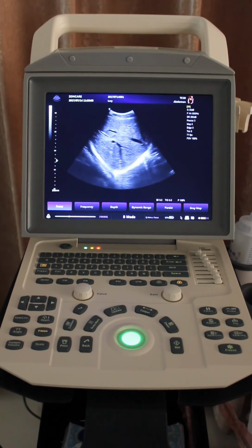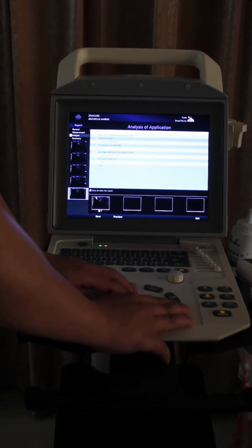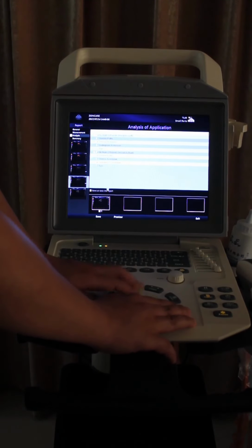Okay. After doing these steps, we need to save. Then we can do the measurement here. If we have measurement data, it will be located here. Then we come to the analysis. If we have any of the analysis, we can also tick it. We can also move the image, same method here. And we should tick it. Save all data into the report. And press save.